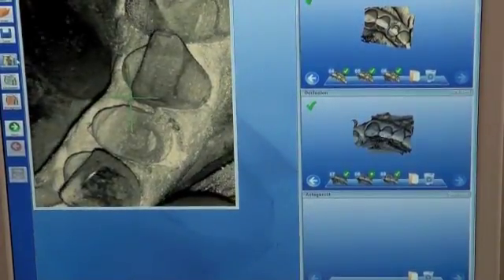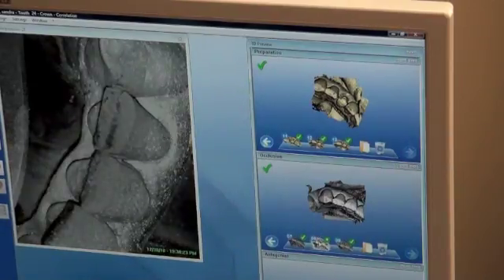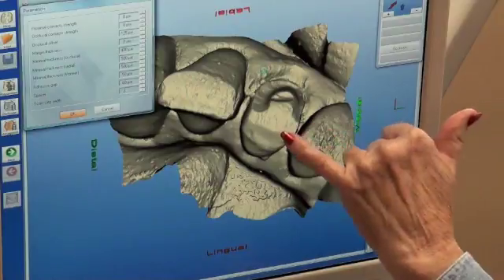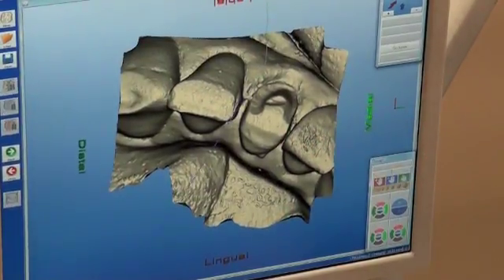Note that the angulations of the images of the prepared tooth correspond closely to the images that were taken of the rough draft. After drawing the prepared tooth into the CAD-CAM program, the tooth in question was then separated from the adjacent teeth and the edges of the prepared tooth were delineated.